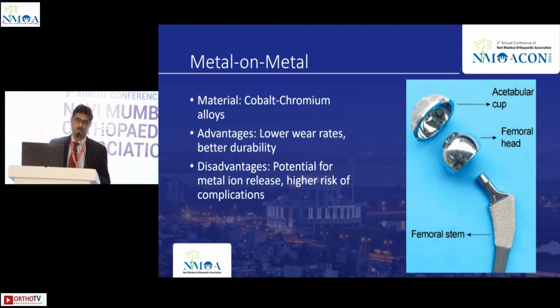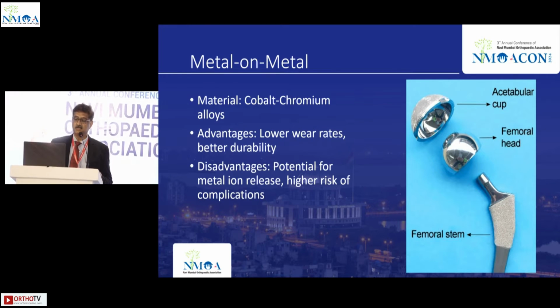What about metal on metal? Nowadays I think no one uses metal on metal. So, cobalt chromium alloys: the advantages were lower wear rates and better durability. Disadvantages? Metal ion release and a high risk of complications.